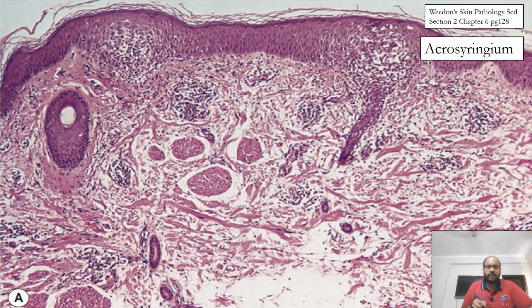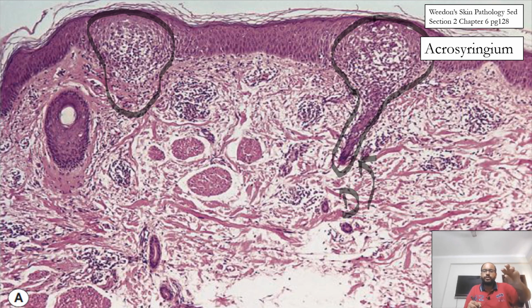So in histopathology, when we biopsy a lesion of miliaria, if we are biopsying a lesion of crystallina, also known as miliaria alba, the vesicles can be seen within or directly below the stratum corneum. You will have an orthokeratotic layer above the vesicle and a normal basket weave keratin below. A PAS positive plug may be seen.